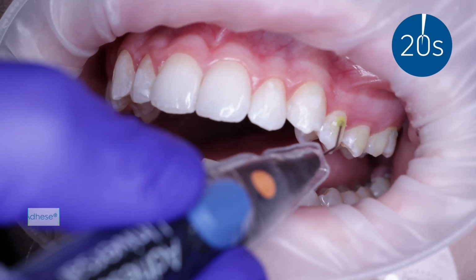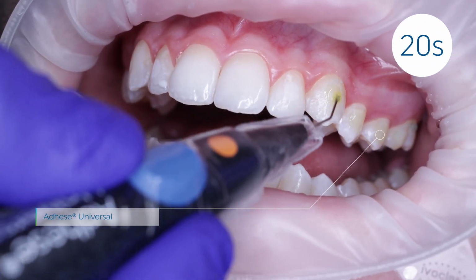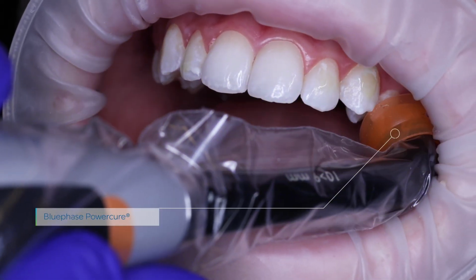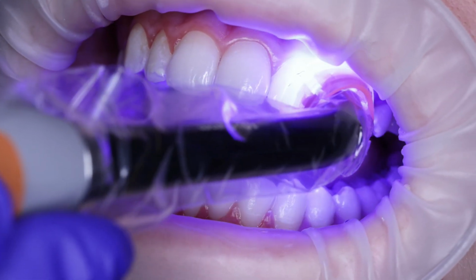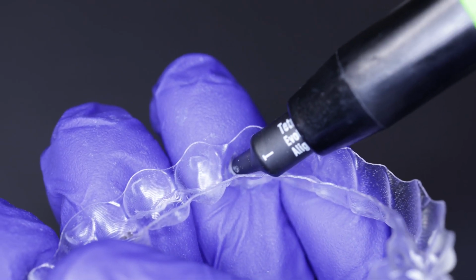So here I'm going to scrub it into all those areas. And remember, this is not a mop. Some bonding agents, you actually mop it on or you paint it on. This is a scrub. And we're going to scrub it in every area that we place. Again, every area we etch, every area where that attachment is going to go, we're going to scrub it in for 20 seconds and light cure each area.